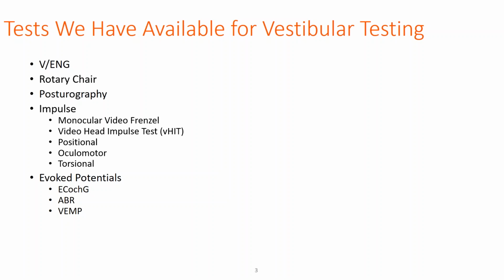But if someone were presenting and saying, I have concerns for my hearing, you wouldn't hang your hat on just the one test. And I think we can start to think about vestibular testing that way as well. You don't just have to do a VNG, you don't just have to do a VEMP. There are so many more things to consider and take home with you.